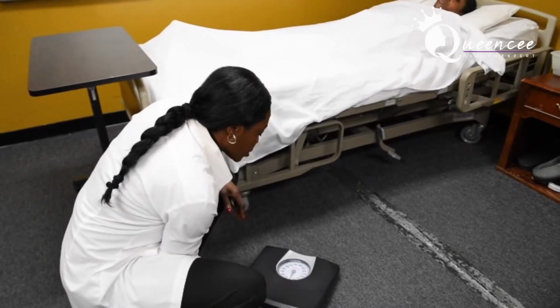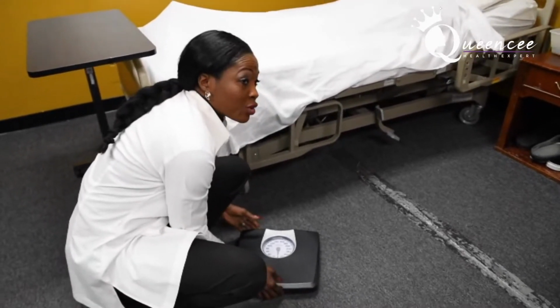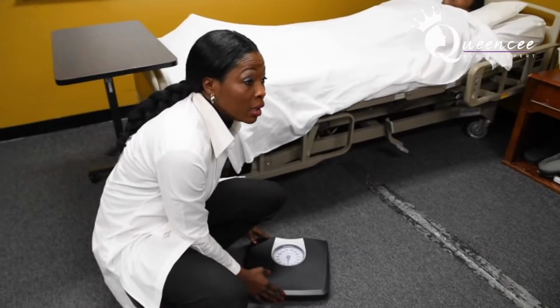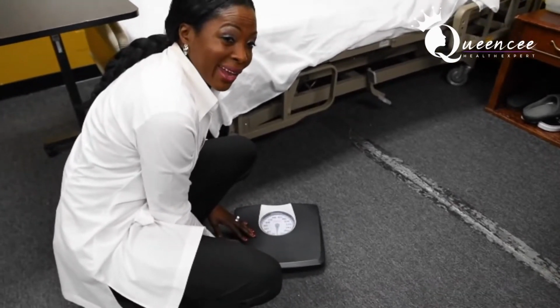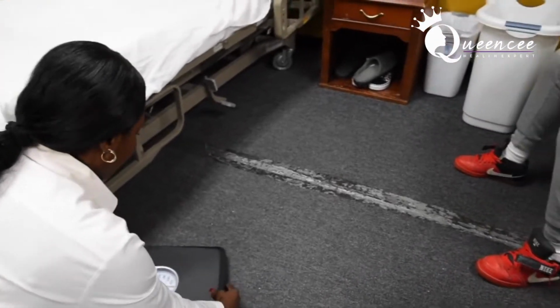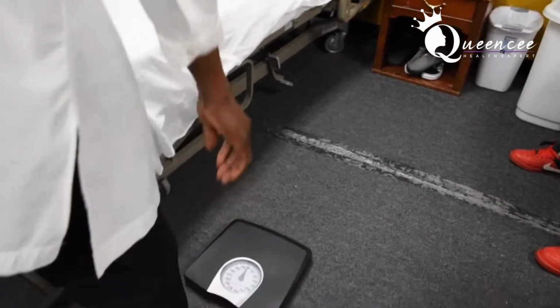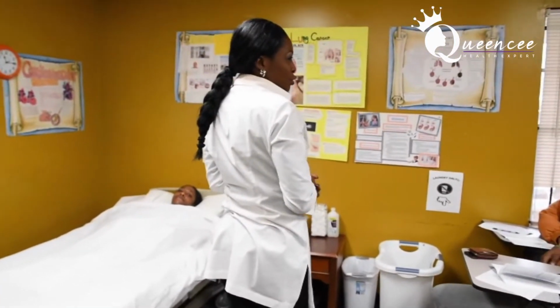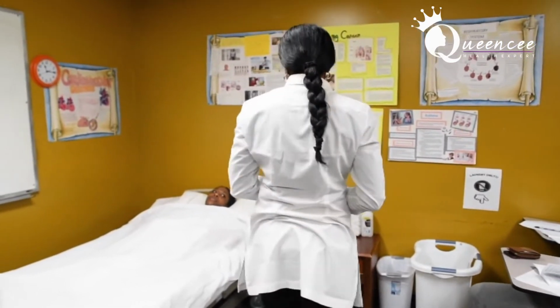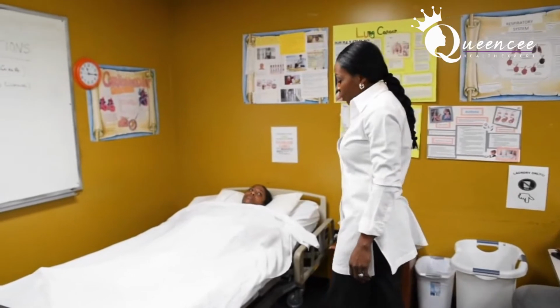If you have long nails, it would be difficult for you. All right, as you know, we're not supposed to have long nails anywhere. When you are trying to balance your scale, you should not rest your other finger on the scale, or else you'll be here forever. So you're doing it with one finger basically. Another equipment you will need is the patient's shoes, so just write shoes as well. So we have the scale, we have the patient's shoes as well.